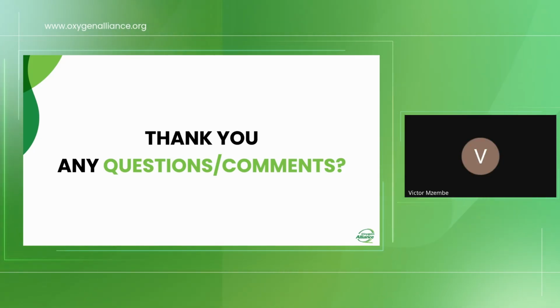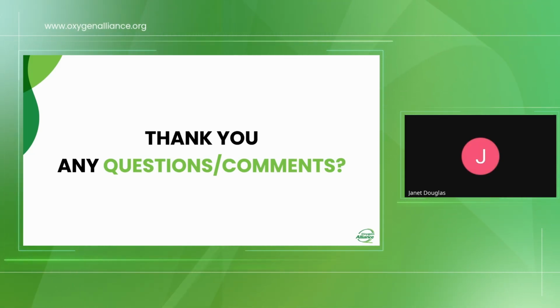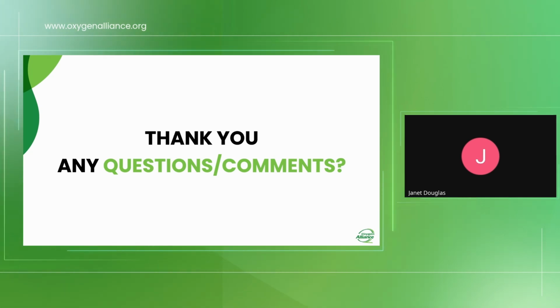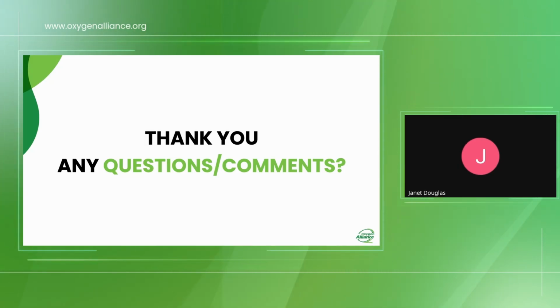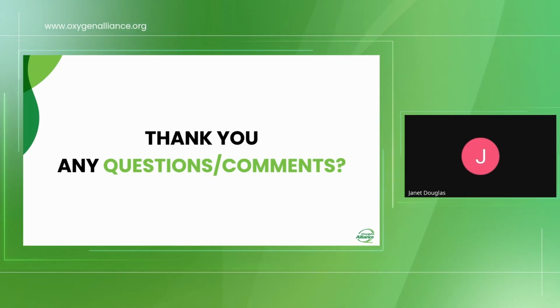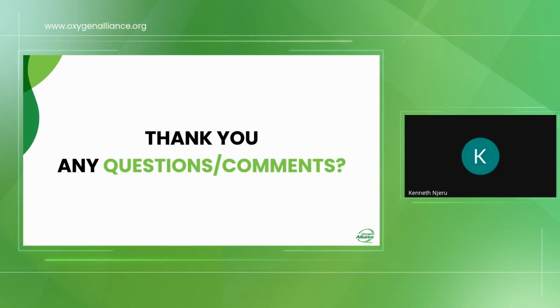Thank you. All right. I see a hand from Janet. Thank you. Of course, mine is just a clarification for Engineer Kenneth, and thanks for joining this call. The first presenter pointed out that there are so many accessories or probes where you can connect your patient monitors to. That's making it multi-parameter. And normally you have the SpO2, you have the temperature probe, you have the ECG, and you have the NIBP. That makes it 4. But I think your point was having 5, which the 5th one should be the CO2, right? Yes, true. All right.